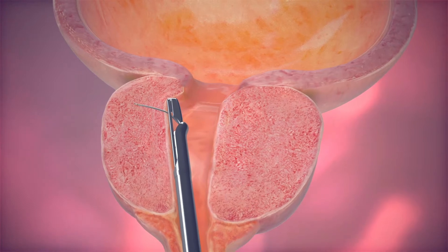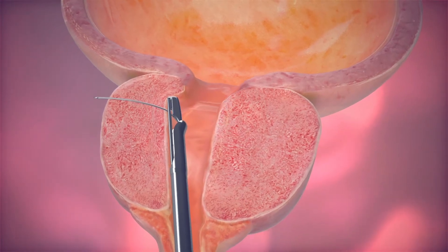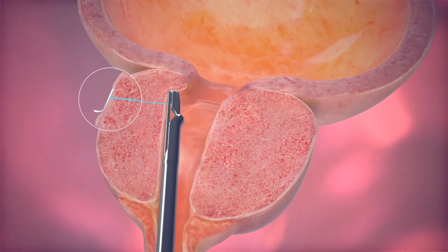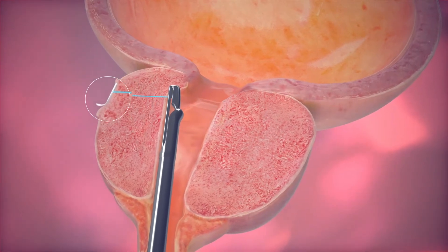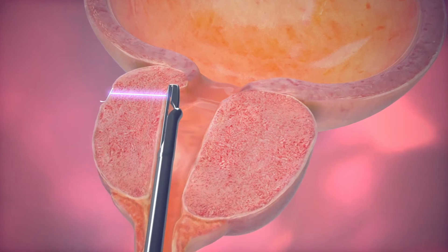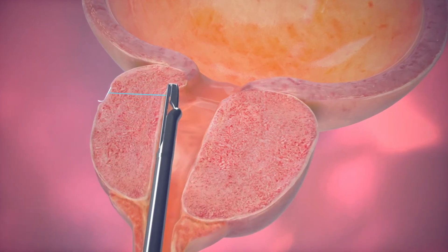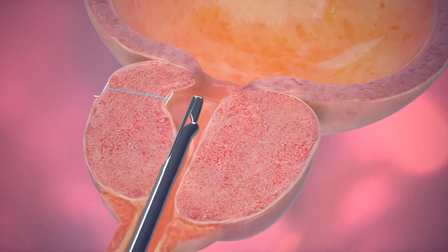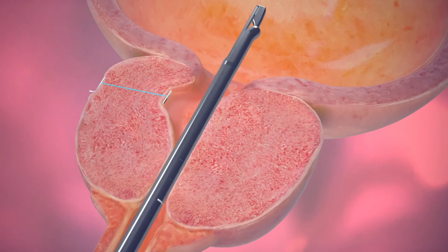A trigger press inserts a fine, 19-gauge hollow needle through the prostate. The next trigger press deploys the implant, anchoring a small nitinol tab outside of the prostate while retracting the needle. Attached to the nitinol tab is a length of monofilament PET suture. The final trigger press completes the implant by placing a stainless steel urethral end piece onto the suture.